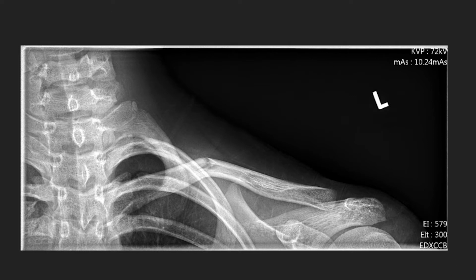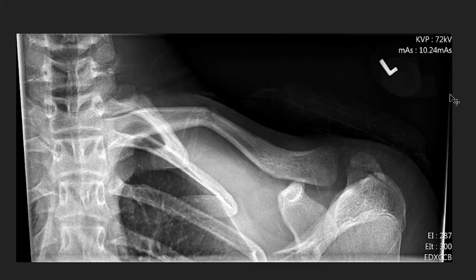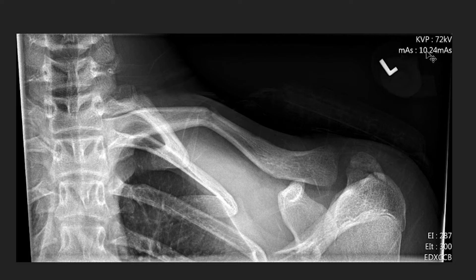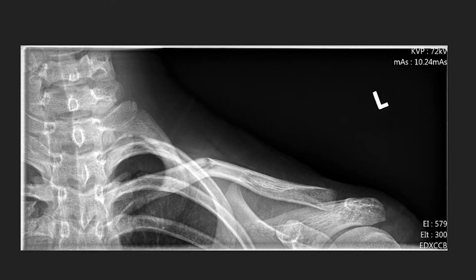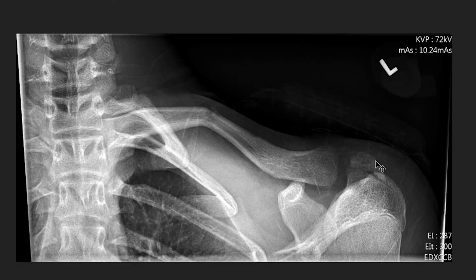We go to image two — same technical factors, 72 kV, 10.4 mAs — but that says 287 for the EI. So the same technical factors, just like in our podcast we were talking about, produced a different exposure indicator. Although this particular one, the first one started out as overexposed with 579. The second one turned out right around target range, just slightly underexposed.